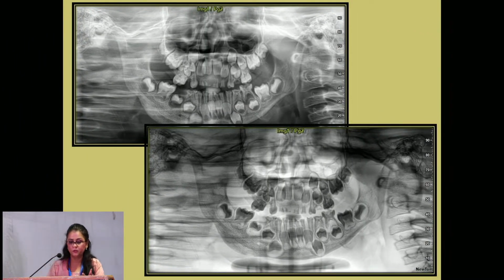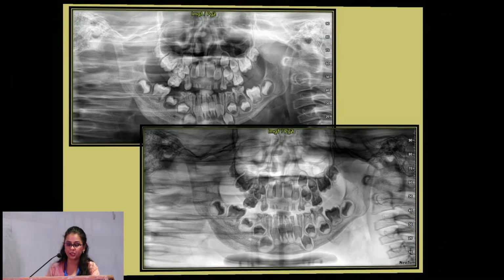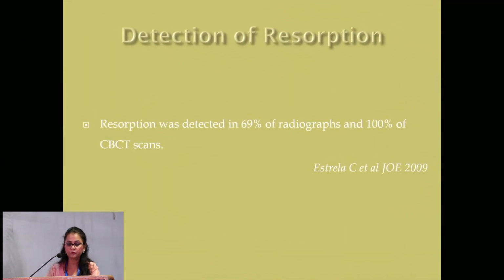This was a case that had come during COVID, a very young patient, where there was a periosteal thickening of the bone because the patient was not able to go to a dentist for treatment, and there was a periosteal reaction that you see here.